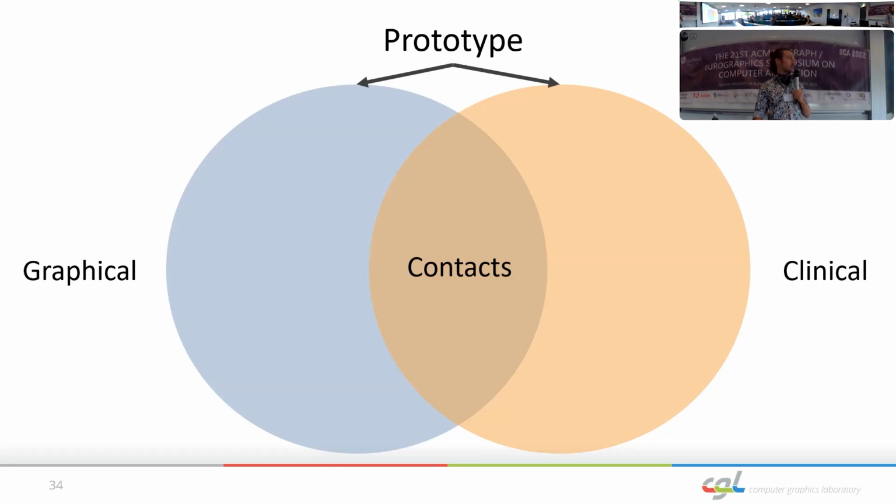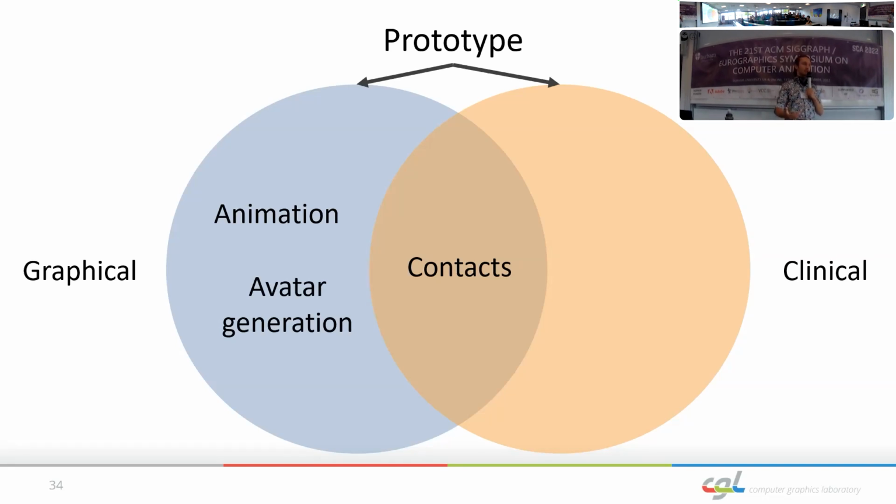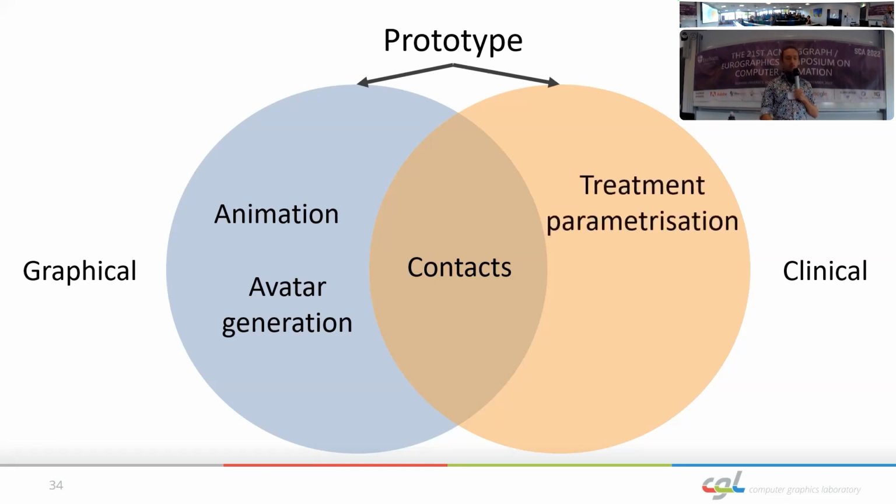From a graphical perspective, we would like to see further work done on animation to make the avatars more realistic and be able to communicate the post-treatment state of the face better, as well as avatar generation, such that preparing the simulation meshes and the renderings takes less work for the doctor and is more realistic. On the clinical side of things, there is a lot of interesting work to be done on the treatment parametrization.